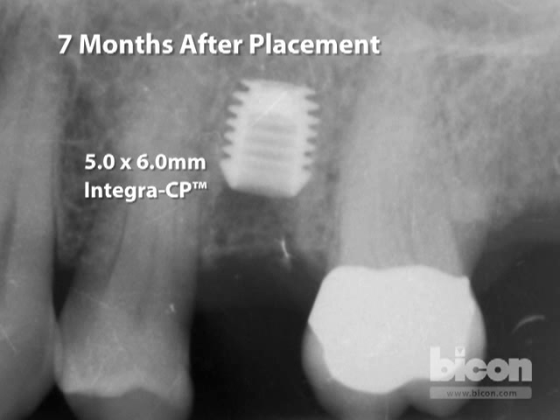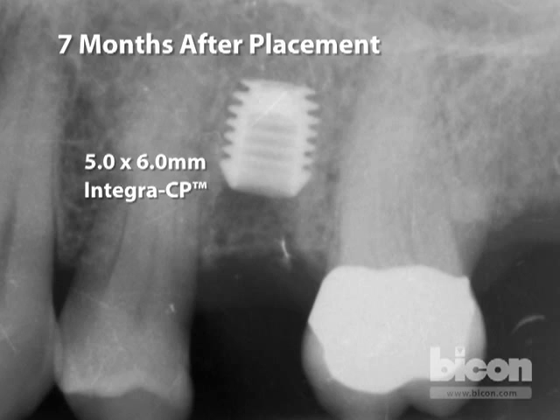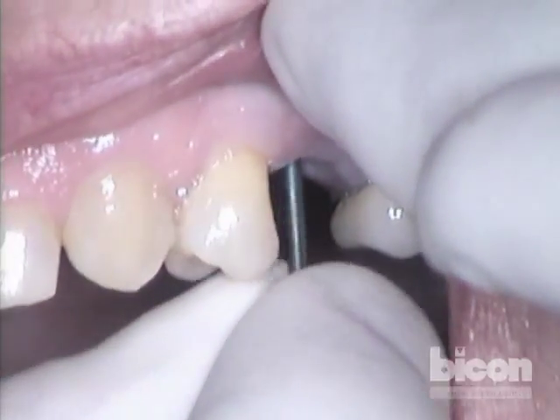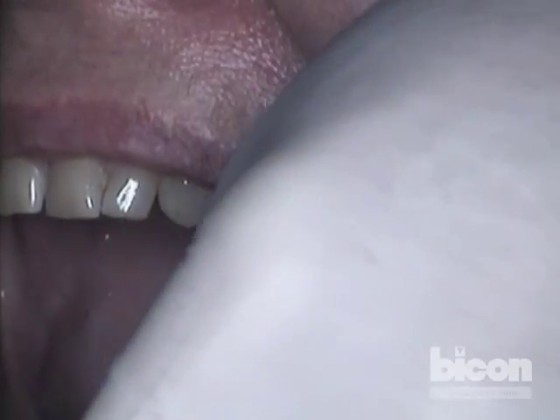So there's a short Bicon implant — or abutment rather. The patient has anesthesia. Now it's just a matter of locating the well of the implant; I'm going to use the back side of a guide pin. It's clearly there. The post is cleaned with alcohol.